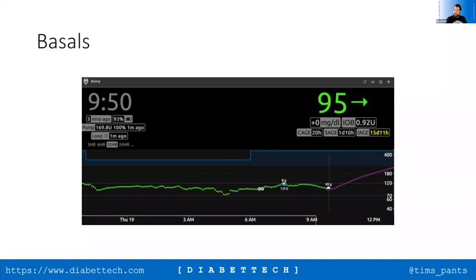It looks perfectly all right, doesn't it? It's running between 70 and 120. It's flat. It's an overnight trace. But what should the target have been? So is this okay? Is the big question. Well, it could be. On the other hand, it might not be.